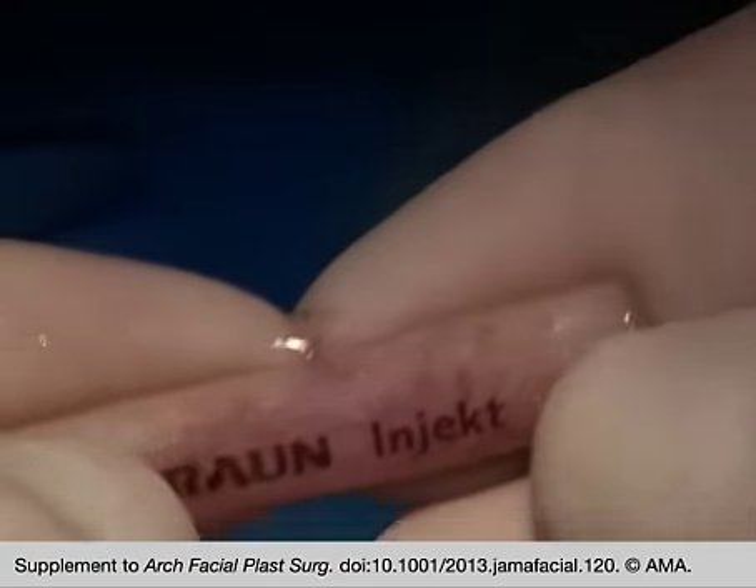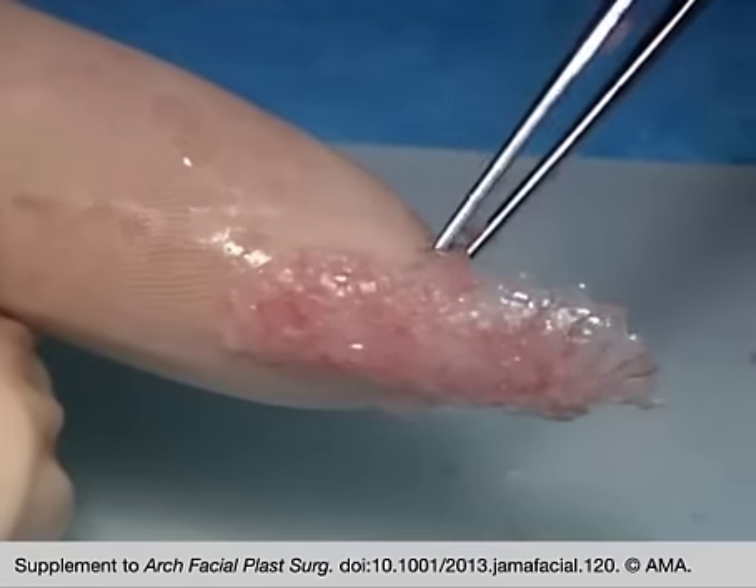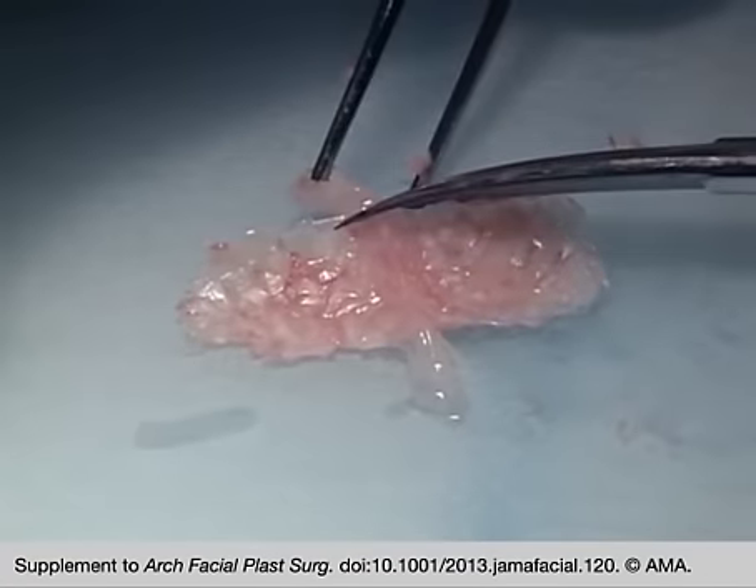Excess glue is squeezed out of the graft immediately again by compressing with both index fingers. The graft is held until the glue has polymerized.